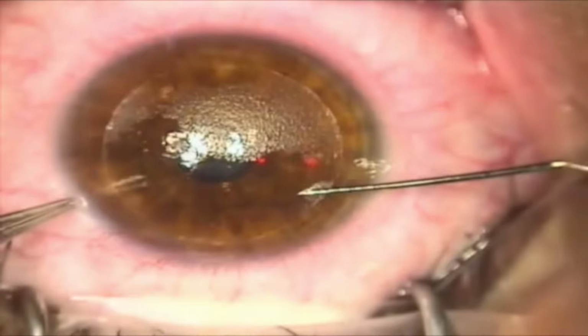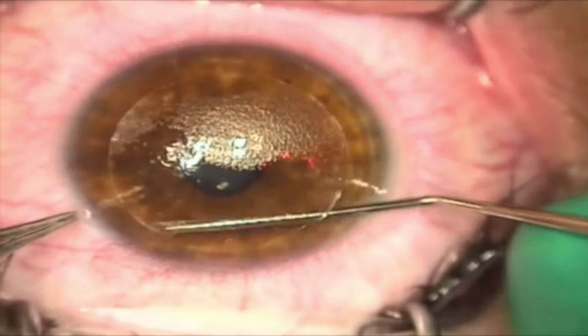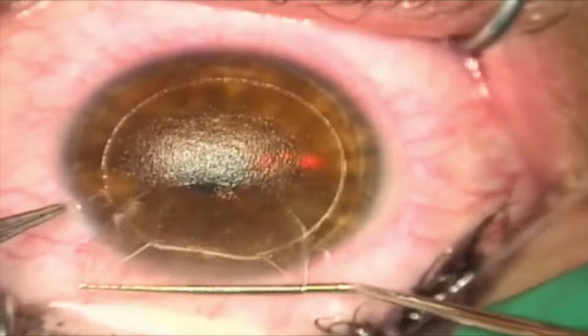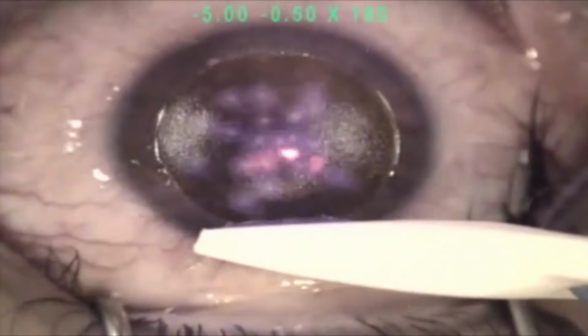Next, we'll be rotating the patient to the excimer laser, where we will use a spatula and gently separate the lamella, and we'll taco the LASIK flap. This is 110 microns intended flap thickness. Next, we'll ensure that the patient has properly tracked the laser tracking correctly. We'll apply the excimer laser.